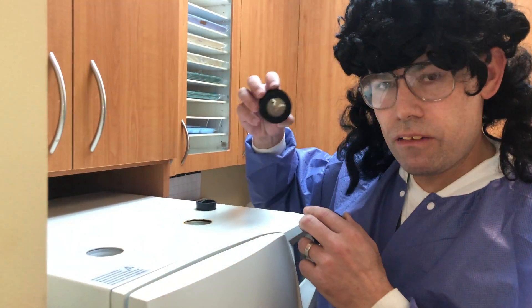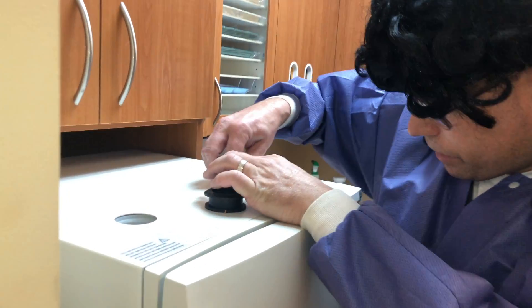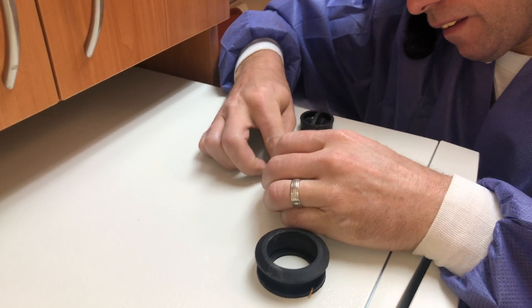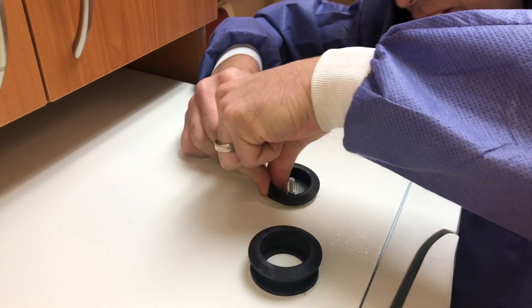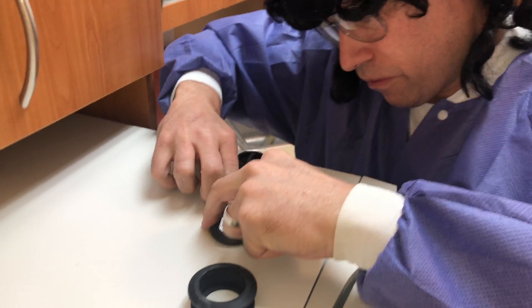The last thing to do is reinsert these rubber components. They've got kind of a lip on both sides, so you've got to finesse them in there. And if you can't finesse them, then just get aggressive with them.